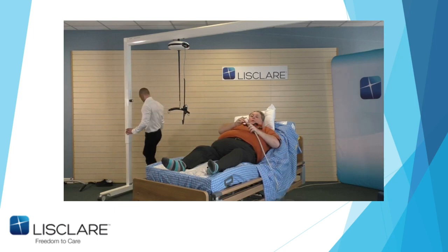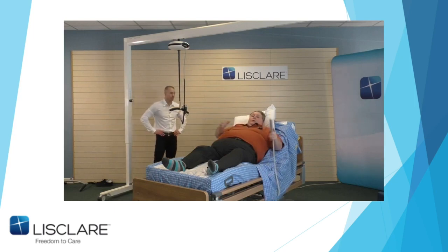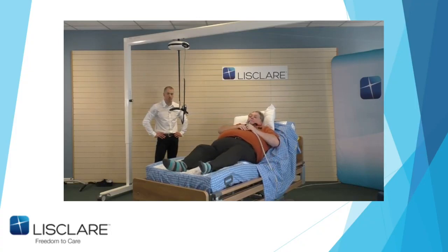I would normally assess whether or not the client is being left with the handset themselves. If you leave the side rails up, you don't need to tuck the sheet in. You want them to bring it down with them if they do happen to spasm or go down. The reason why I like this shorter sheet is my heels are always on the silk. So therefore, if I'm moving, I'm not doing any friction on my heels.